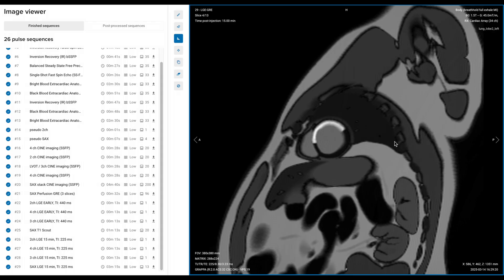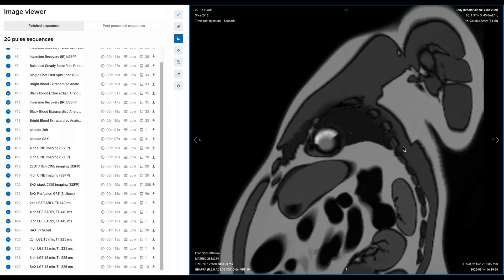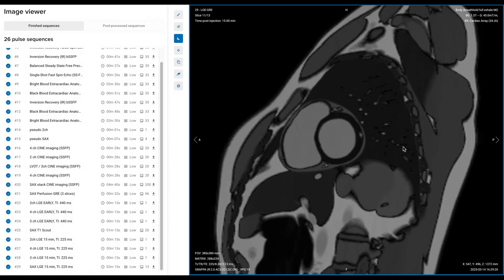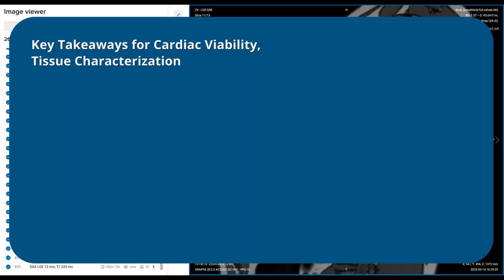That's why it's so important to perform this protocol right — the doctors rely on our images to decide whether surgery can help or if it's too late to save the scarred areas of the heart. With that, we have completed the full cardiac viability study. Let's recap with the most important takeaways. First, timing is everything when doing contrast-enhanced cardiac MRI. We capture three different phases from a single contrast injection, where each phase shows different types of heart damage.